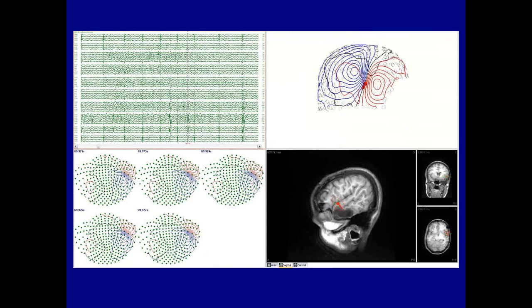If you look at the EEG at the same time, you see a very weak field. It is there because EEG can see all source orientations, but it is not above the ongoing background noise level. So the field may be there, but you can't see it. In this particular case, this very nice MEG field is because the person still has spikes from the superior temporal plane, which produces a very nice tangential field that the MEG sees quite well.